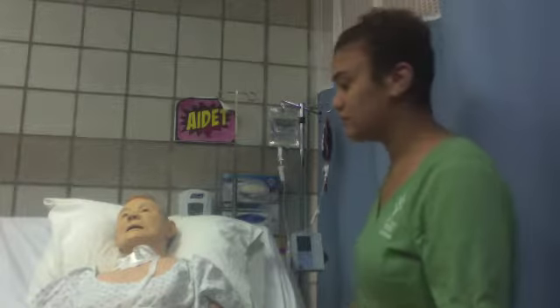I want to make sure that there's no reactions for the first 15 minutes. I would take vitals at 5, 10, and 15 minutes, and I would be in the room the entire time for the first 15 minutes to verify that there are no reactions happening.